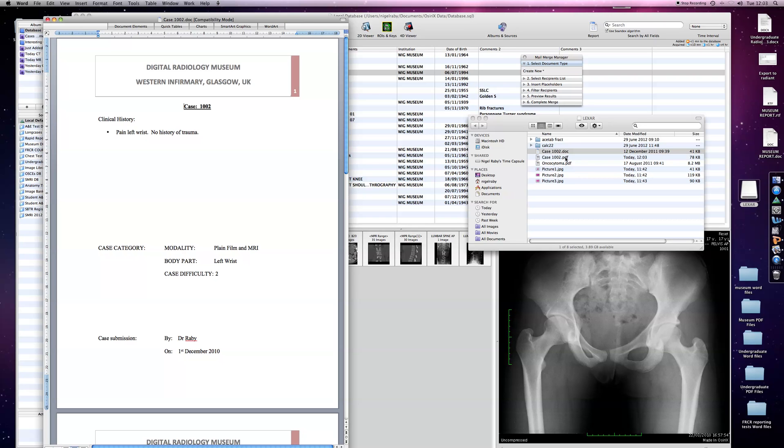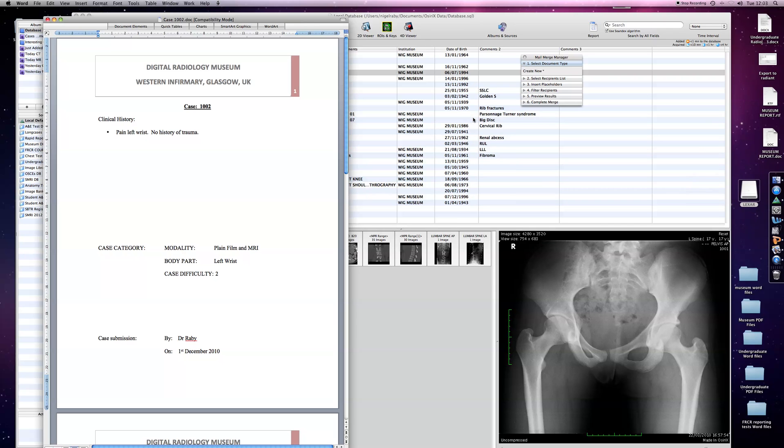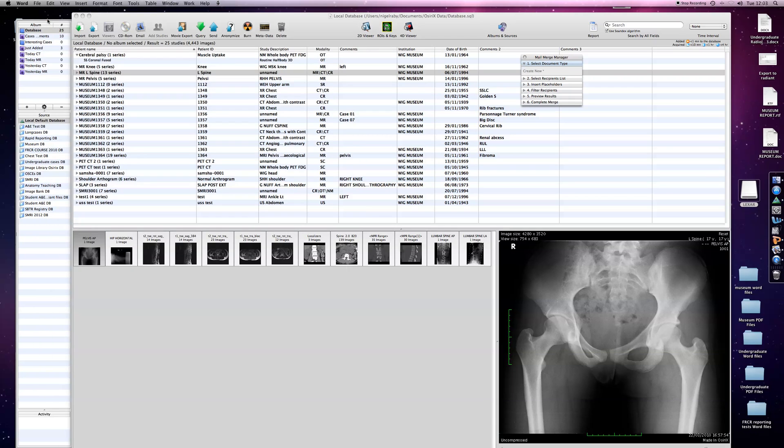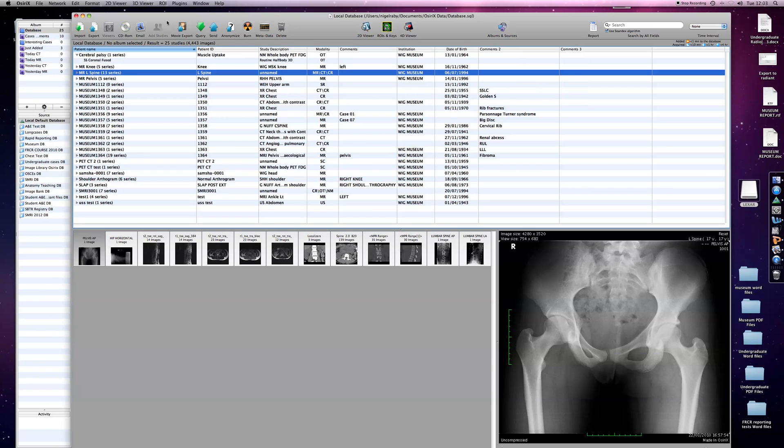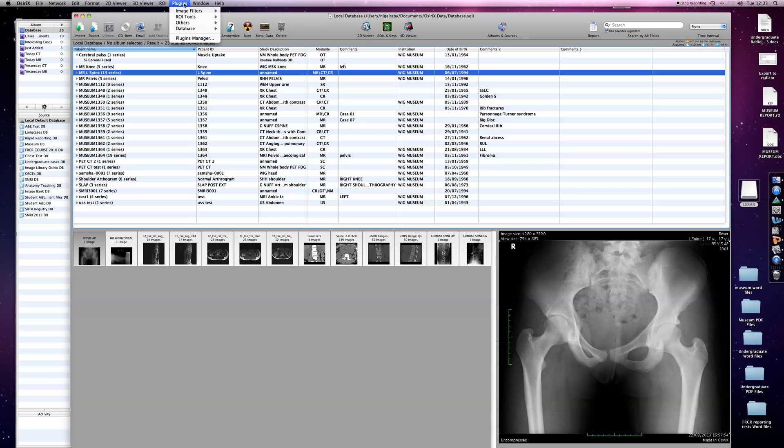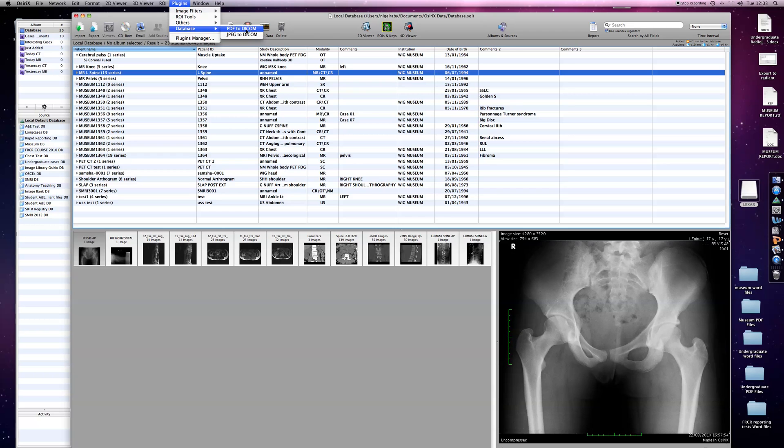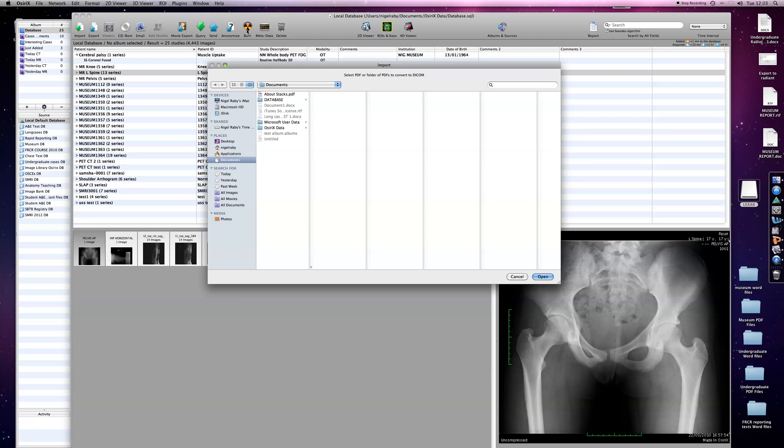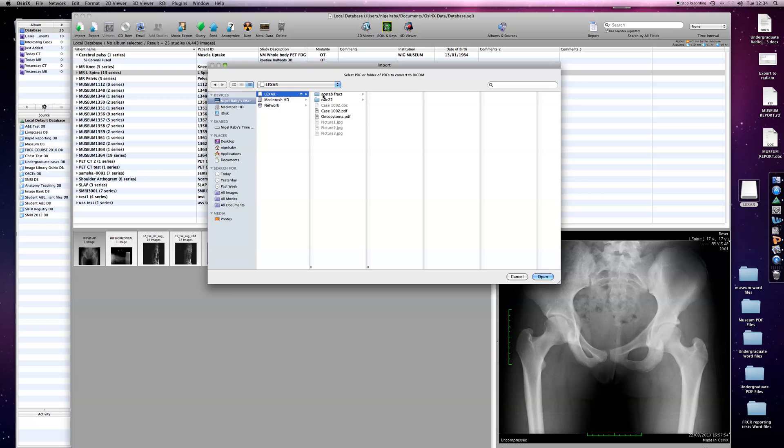You'll also see I've got some JPEG files and another PDF file which I'll talk about. However, we can close that down now. To add that information to a case, highlight the case you want within whichever database you want, then go to Plugins, Database, and we're converting a PDF to DICOM. Find where it is—in this case, it's within my memory stick. Here is the PDF file Case 1002 which we've just created. Click on Open, and you'll see that now appears.